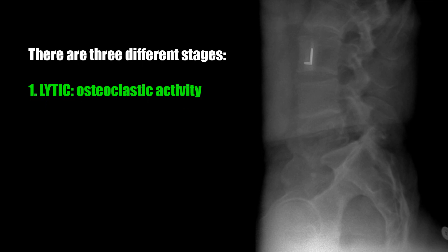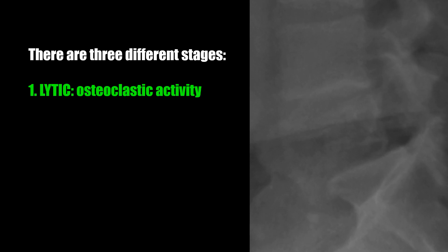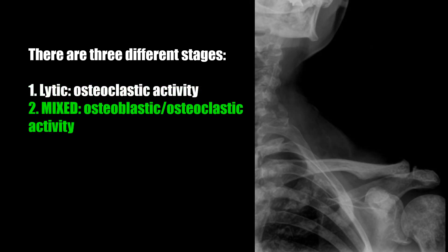There are three different stages of Paget's. The first is lytic, where you have osteoclastic activity. Here the L5 vertebral body is osteolytic in appearance, as opposed to what we typically expect from Paget's, which is an increase in bone density.